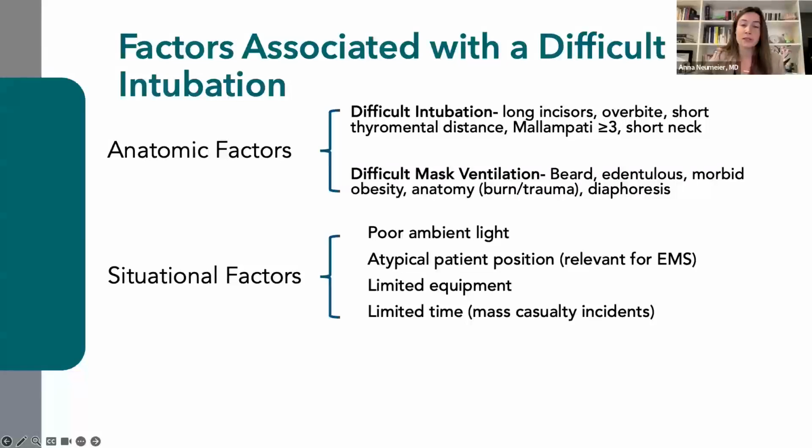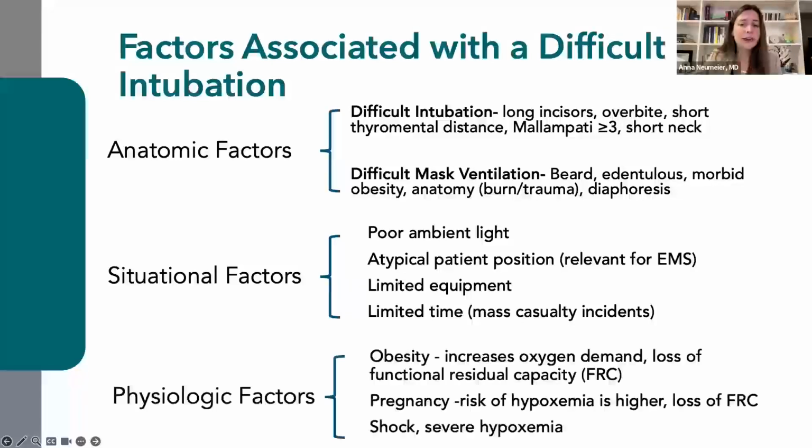For example, the presence of poor ambient light can influence your visualization. Atypical patient position, which is particularly relevant for emergency medical service providers, can influence the complexity and challenge of the procedure. Having limited equipment or limited time in the setting of a mass casualty incident are also situational factors that must be considered. And finally, physiologic factors should be considered as they will add complexity to the procedure of intubation when they must be managed.